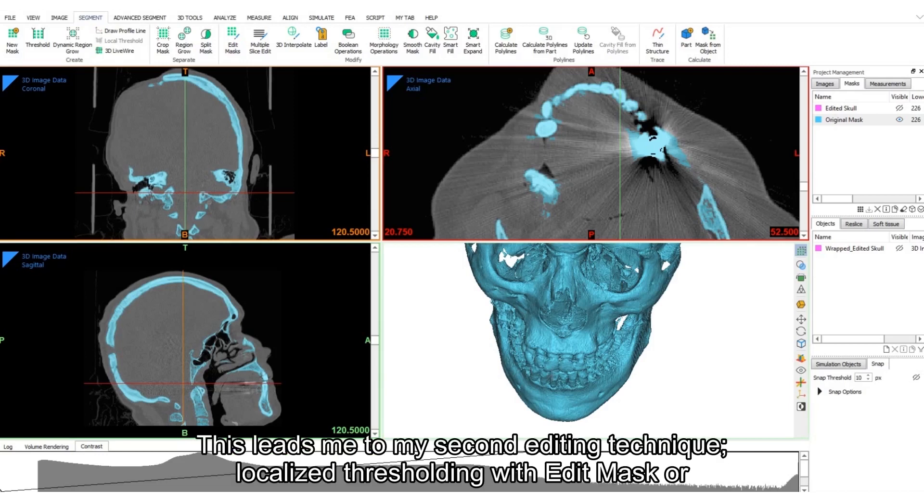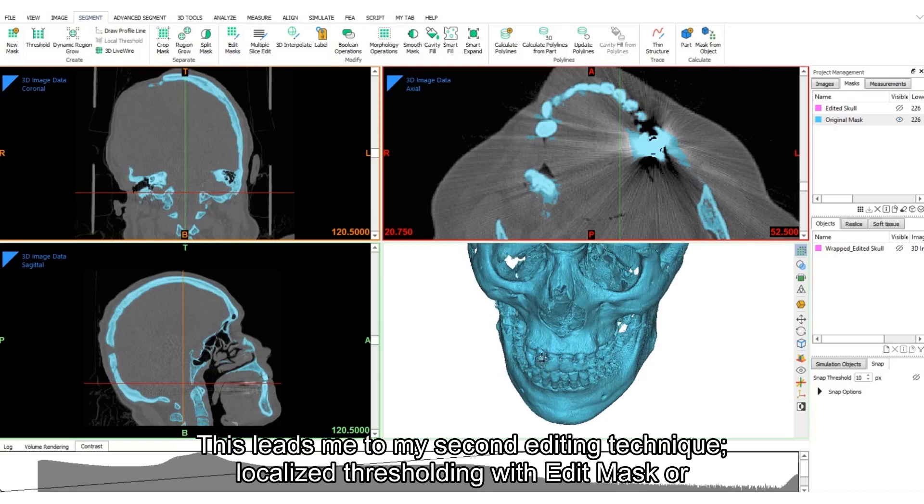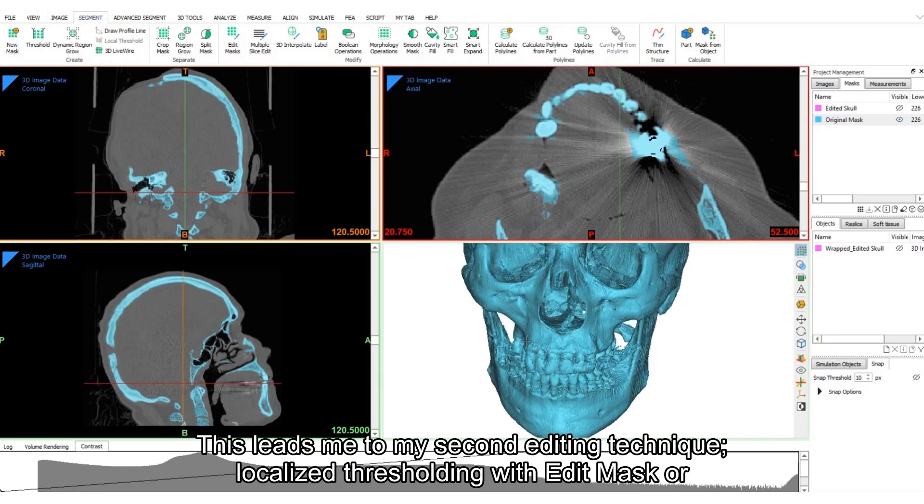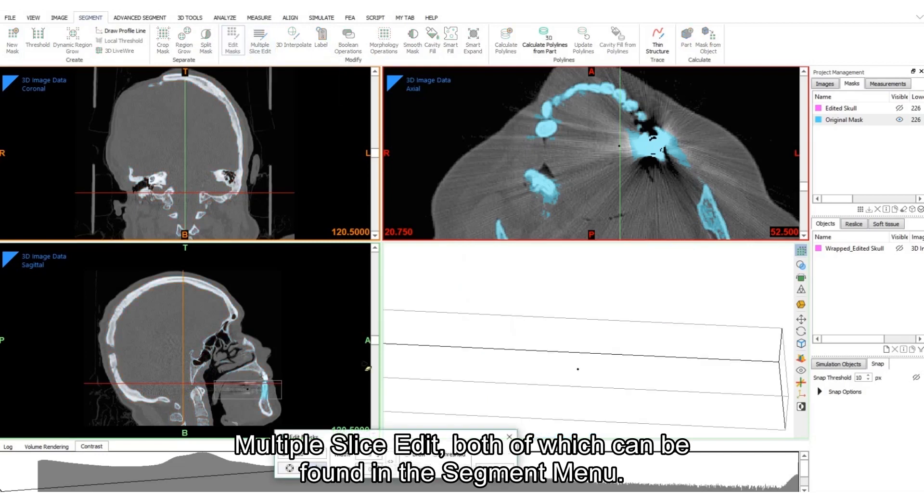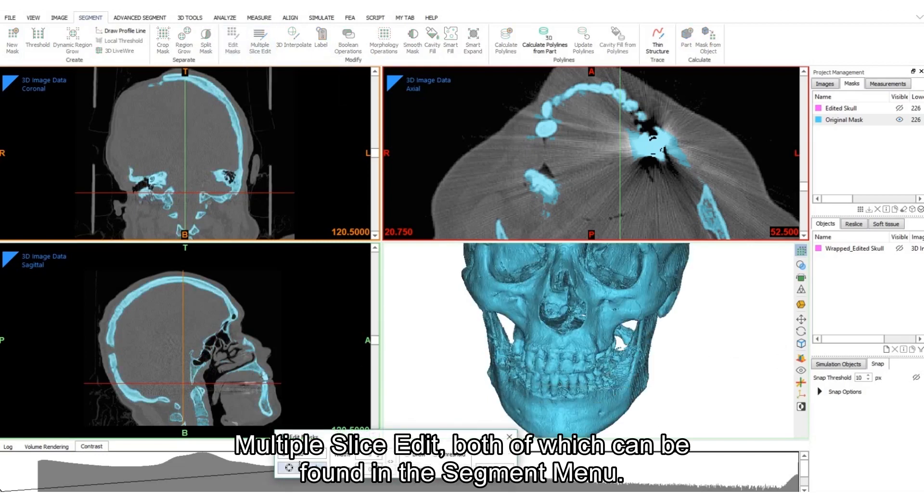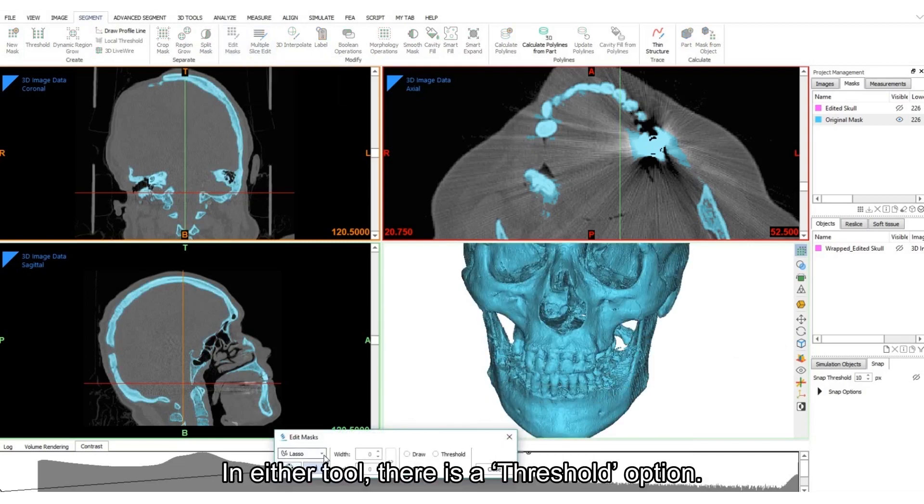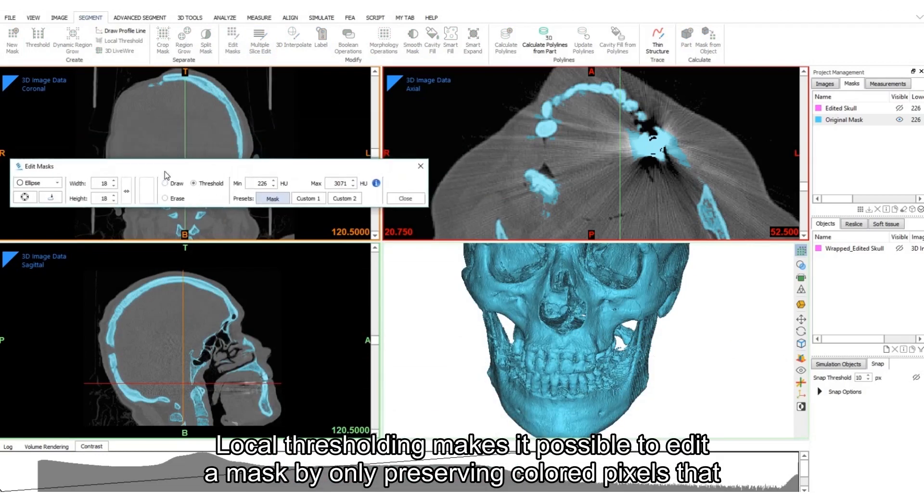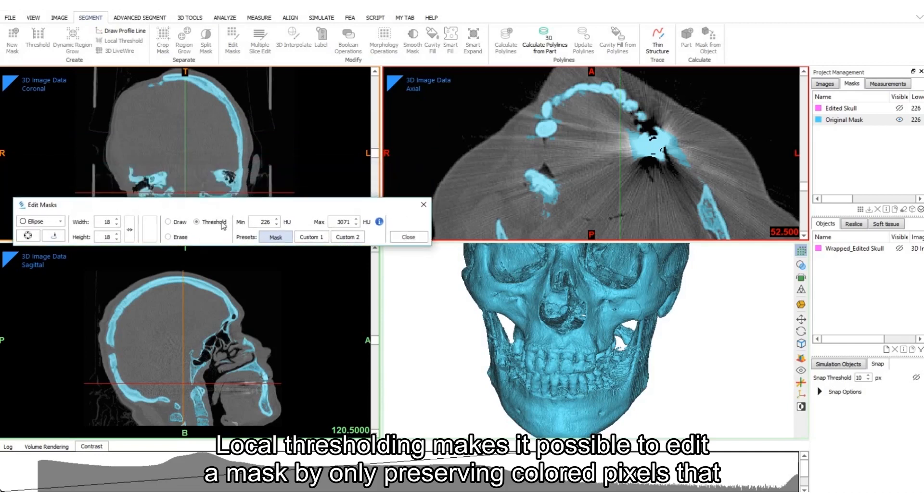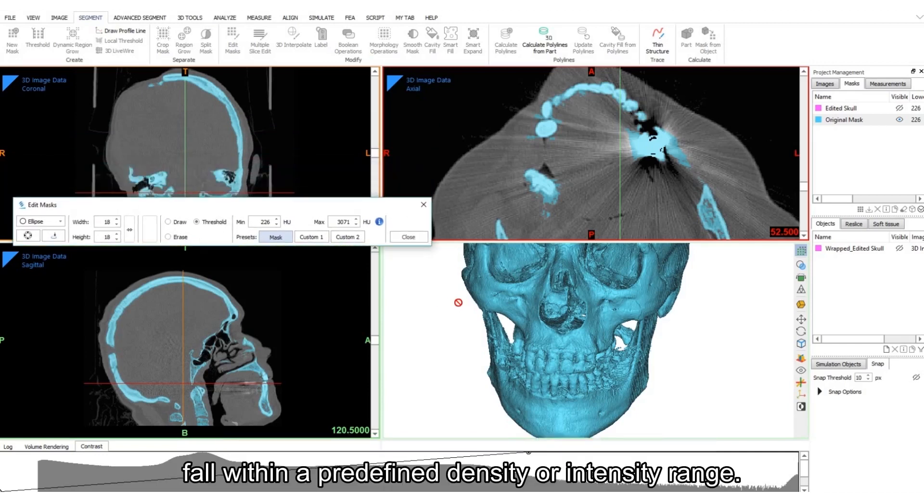This leads me to my second editing technique, localized thresholding with edit mask or multiple slice edit, both of which can be found in the segment menu. In either tool, there is a threshold option. Local thresholding makes it possible to edit a mask by only preserving colored pixels that fall within a predefined density or intensity range.